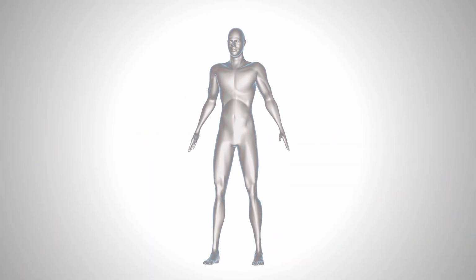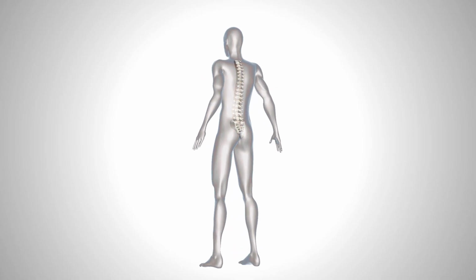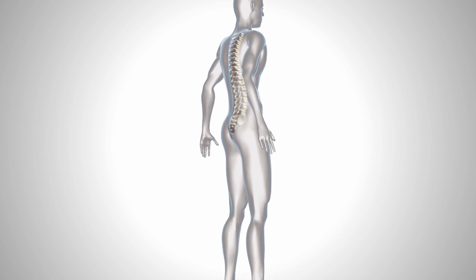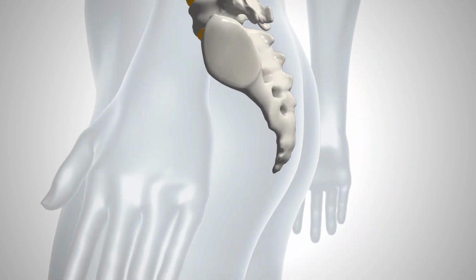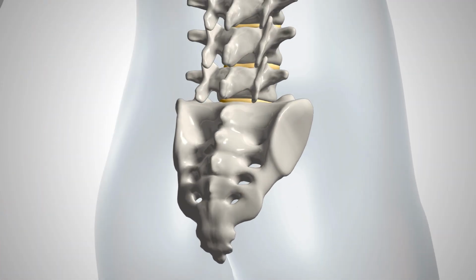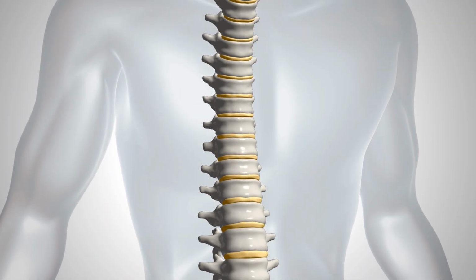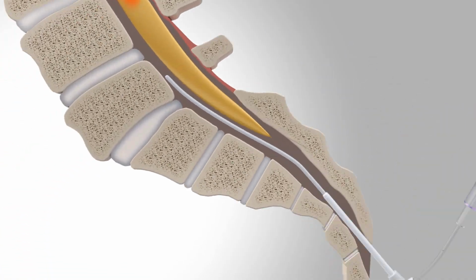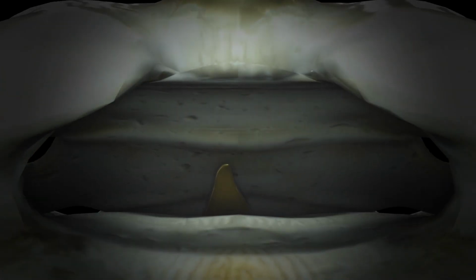It is one of the frequently asked questions about SELD. Imaging our body in 3D brings you to the right way for a successful SELD. There are a few surgeons who insist on the ventral trajectory, which makes it time-consuming for nothing. It is because the surgeons tend to imagine our body structure in 2D of AP and lateral, not a structure in 3D. When the approach of the Veeler catheter is mentioned, to say the approach to the target point is more reasonable than to say ventral or dorsal approach. It is important to get to the correct target point, not ventral or dorsal approach.